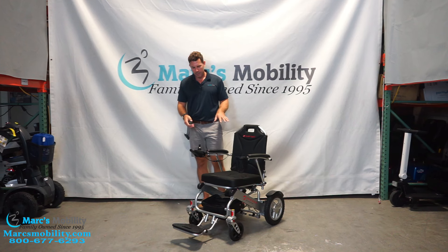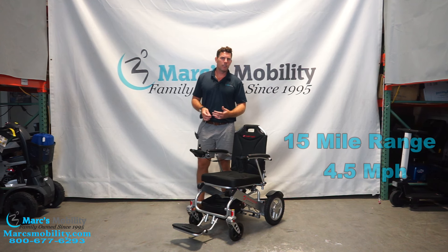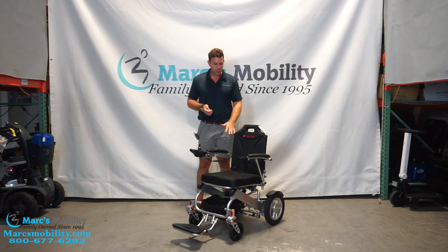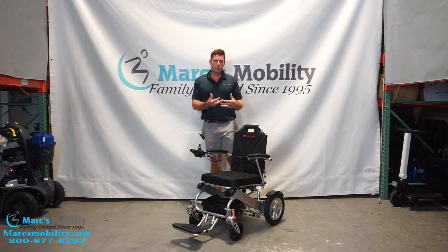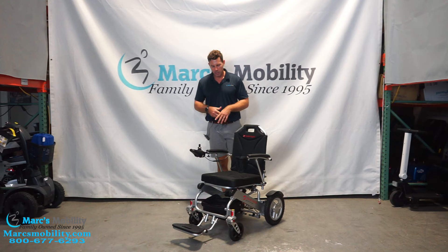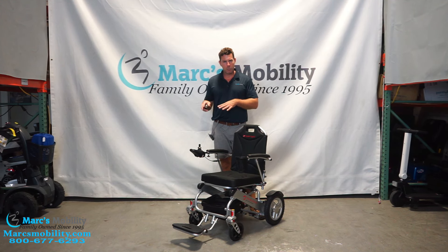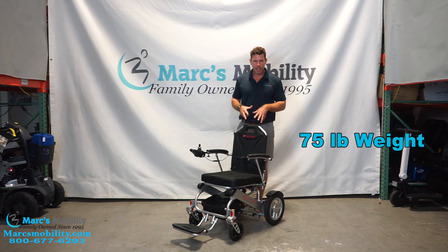This power chair has a 395-pound weight capacity and will go up to 15 miles in range. It tops out at about 4.5 miles per hour, but what makes this unit great is it folds up, has a high weight capacity, and you're able to detach the two rear motors and wheel assemblies to bring the weight down. When fully assembled as you see it here, we weighed it at 75 pounds — which is different from what the specs say online, because we actually weigh our units.